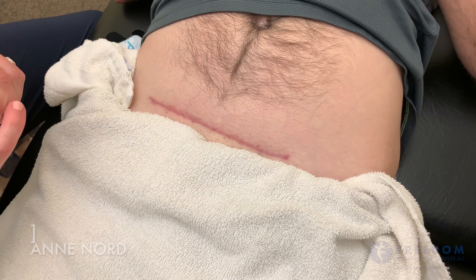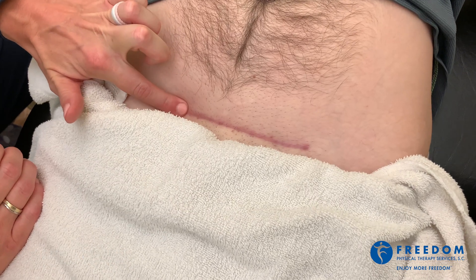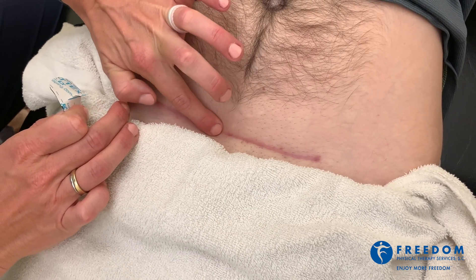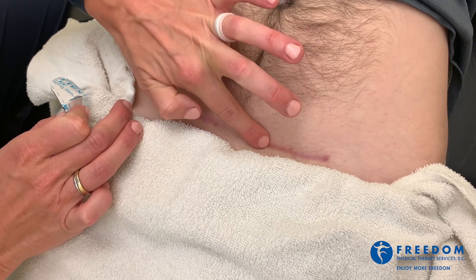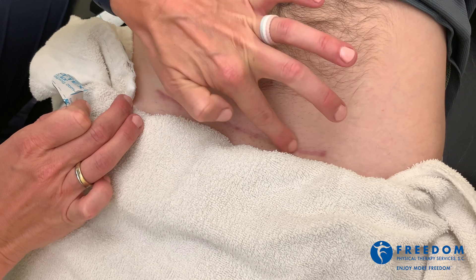Here we're doing some scar mobilization taping. We have a scar from a surgery in July and you can see that it's quite adhered, especially as we move to the midline section of the scar. It's an abdominal scar from an anterior approach of a spinal surgery.